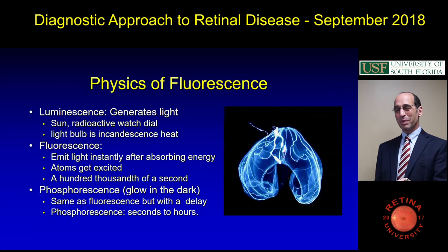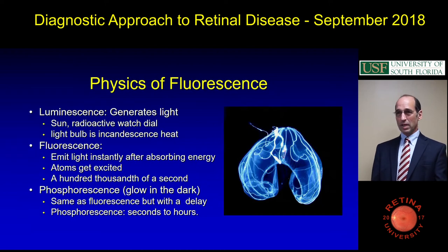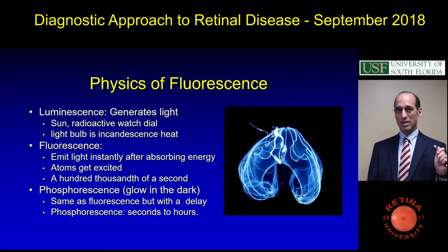I like this because people are talking at meetings now about cyanescence. They'll show an ICG, and I've seen it published in journals. They'll say, this cyanesces, which is not a word. So don't use it, please, in my conference. Anything can fluoresce, it can luminesce, it can phosphoresce, but you can't cyanesce.